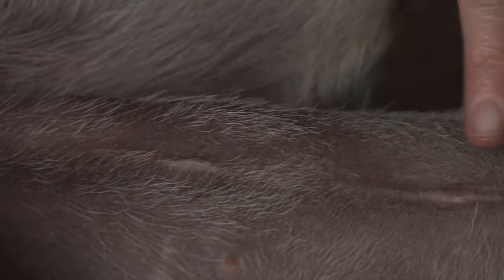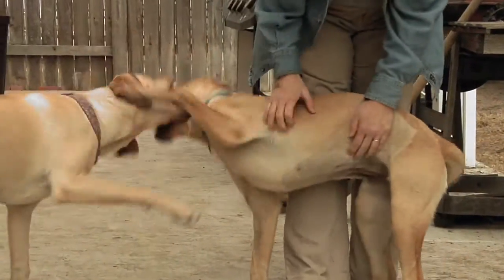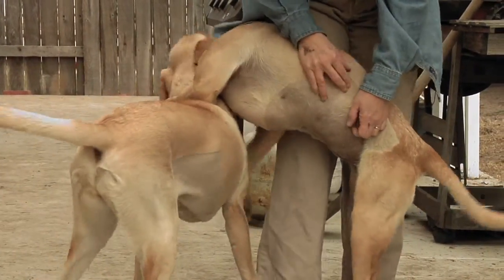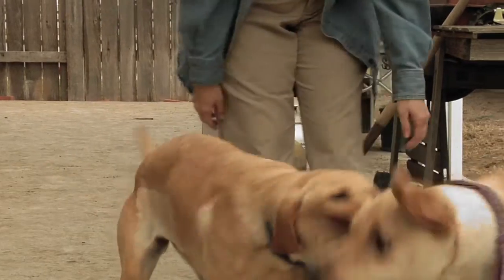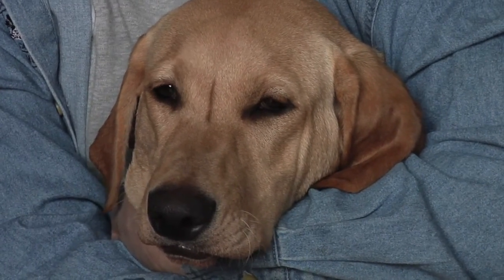There is your belly button, and there is where they did the surgery. And you can see that it's almost the same size. If I ever got another female dog and had to have them spayed, I'd choose the laparoscopic every time. Yeah, it's less pain for you, and makes me feel better.